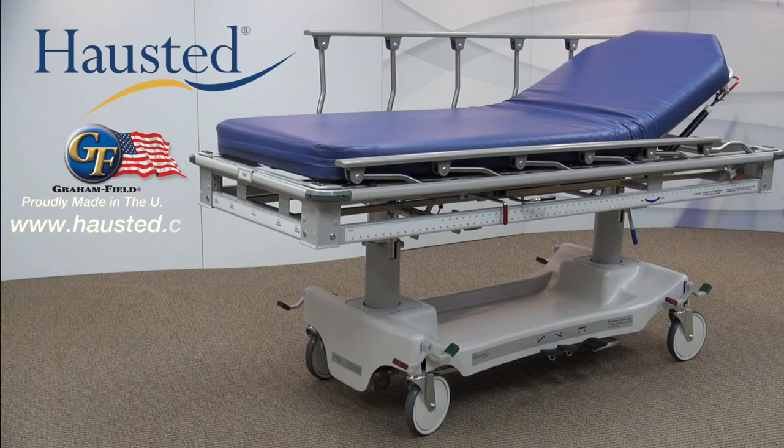To see how the Hausted X-Ray Trauma Stretcher can help you improve case turnaround and streamline patient handling, please contact your Hausted representative today for a demonstration.